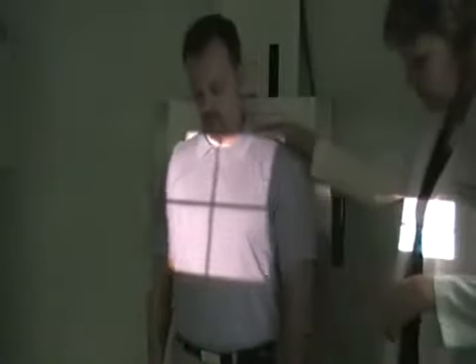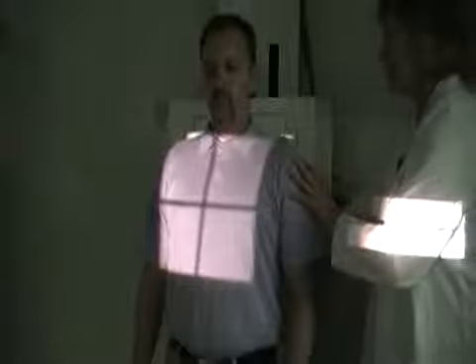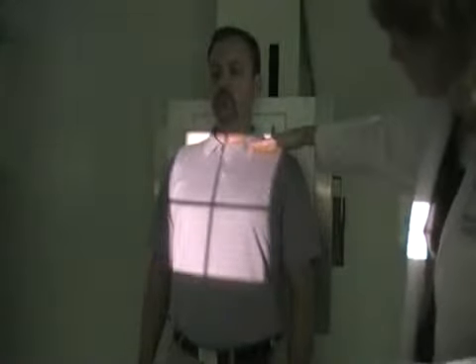I've got the filming crosswise to cover the width of the chest, and what I'm going to have David do is take one step out and then lean back so that the shoulders are touching up against the IR. Okay, now take a small step to the right. There you go, right there. So the patient is angled back so that the clavicles will be thrown up above the apices.